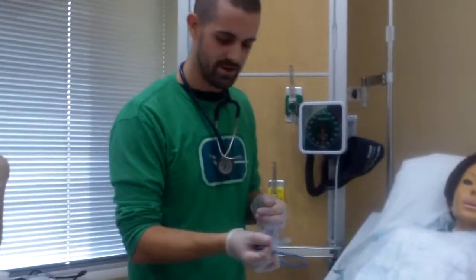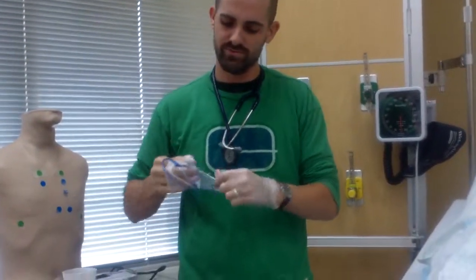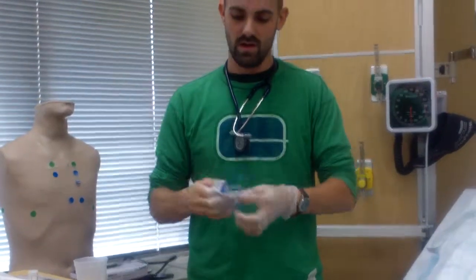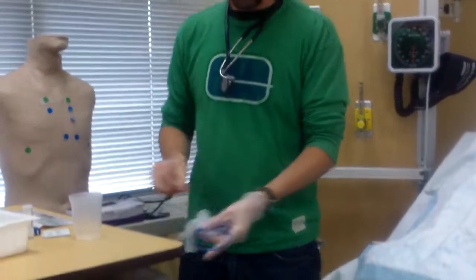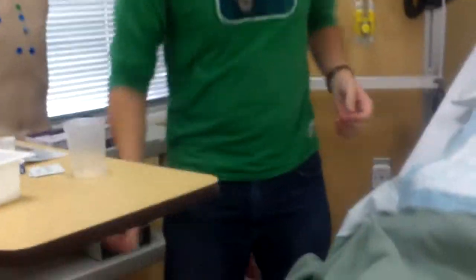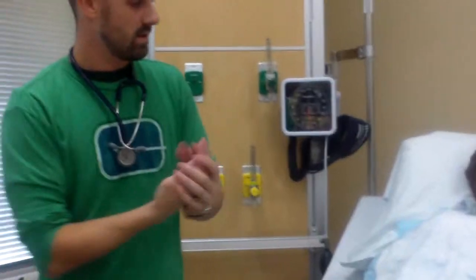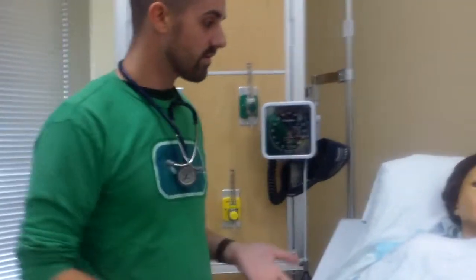That's wonderful. So then I would dispose of this, wrap it up in my glove if possible, and then just discard this as a whole into the trash. We'll put that down there. And hygiene. Okay. Patient is good. I would offer some oral care, definitely, because they probably had this in their mouth for a while. So I'd offer them oral care.